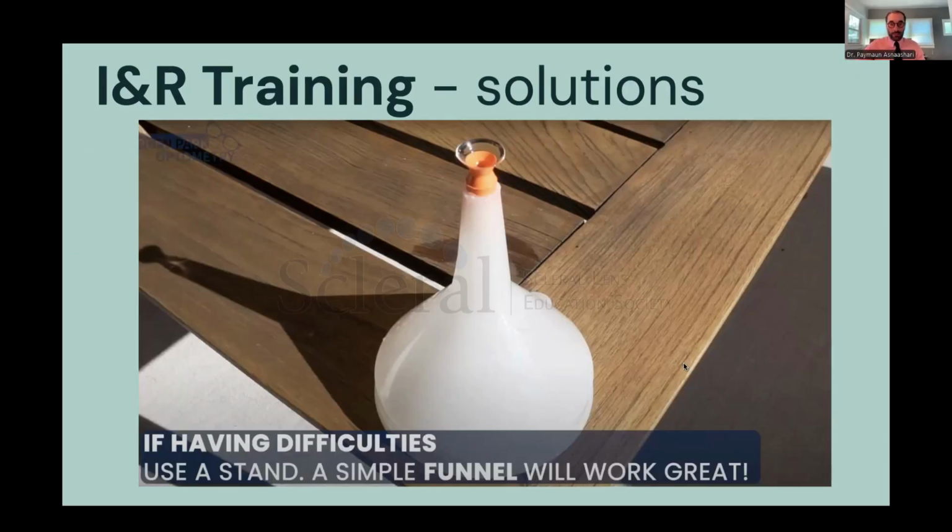So this is actually on my video. This is a screenshot from my video that I made. I actually learned this, and I would give a shout out to Dr. Heidi Miller, who also practices in my area. She told me about this, I don't know, maybe 5 or so years ago, when she said she uses a funnel to help with insertion, and I thought this was kind of crazy.